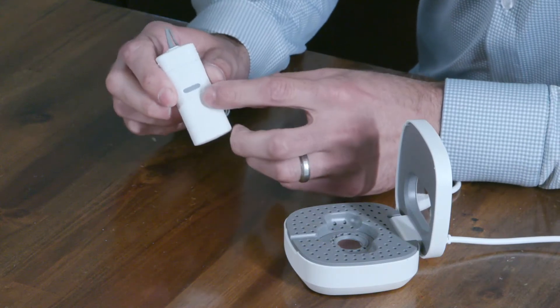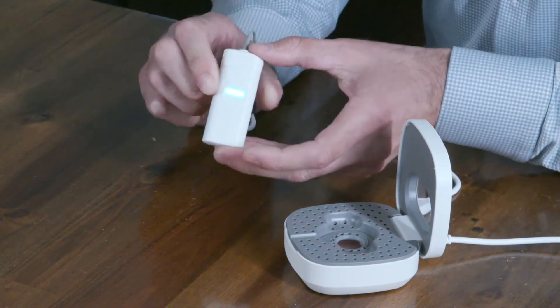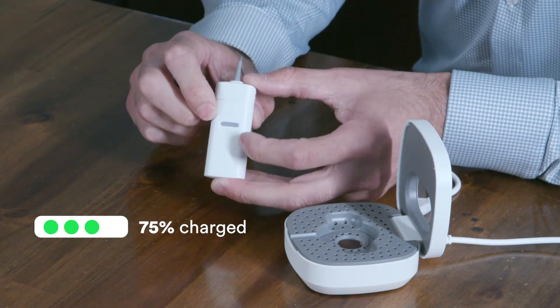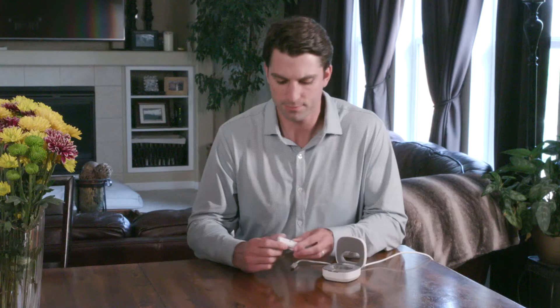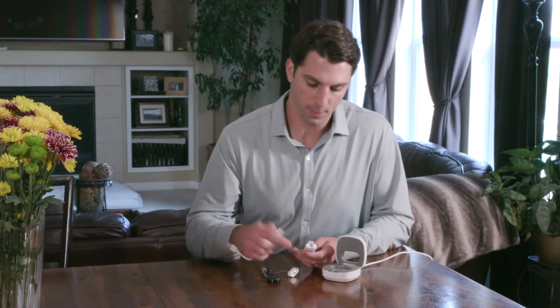To check how much battery is left on the portable charger, click this LED button here. Four display lights means 100%, three lights means 75%, two lights means 50%, and one light means 25% full.